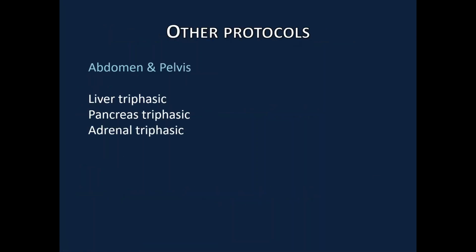Other protocols we won't cover today will be the triphasic of the liver, pancreas, and adrenals. These are used often to evaluate for malignancies or other masses in these organs.